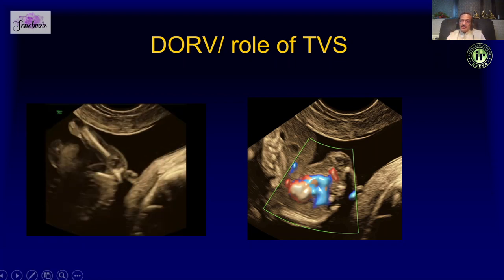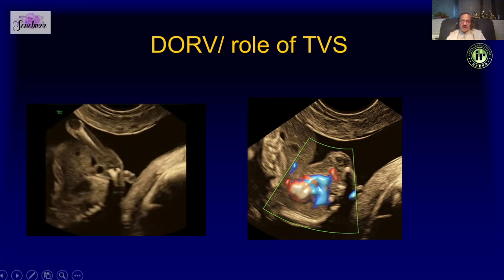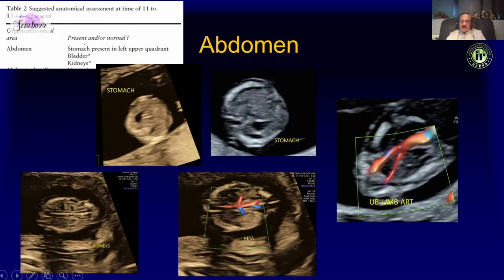Sometimes the fetal position is good and you can do almost a complete target scan. Look at the abdomen, make sure the stomach is present in the left upper quadrant, make sure the bladder is seen and you see two umbilical arteries.